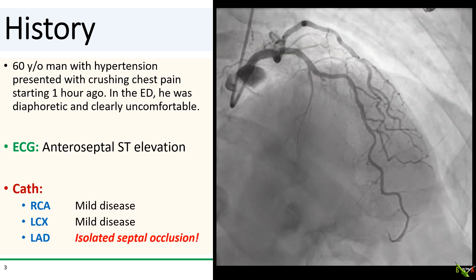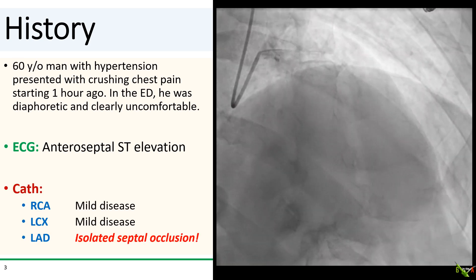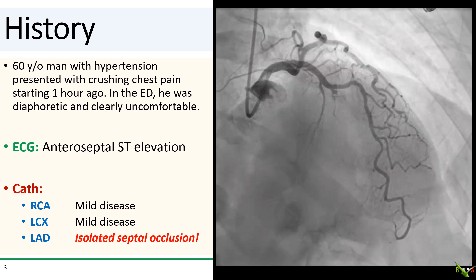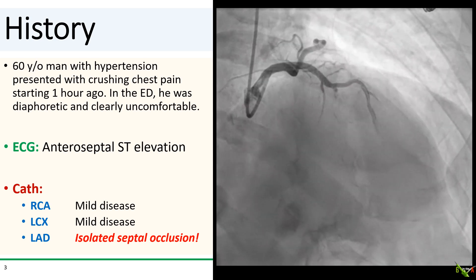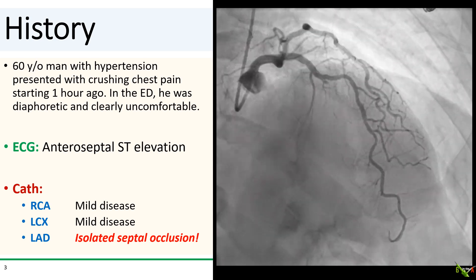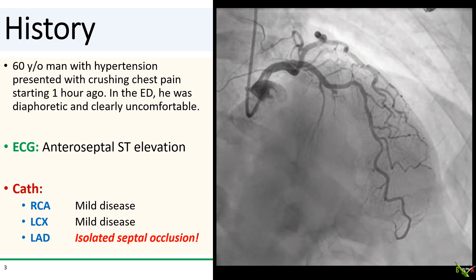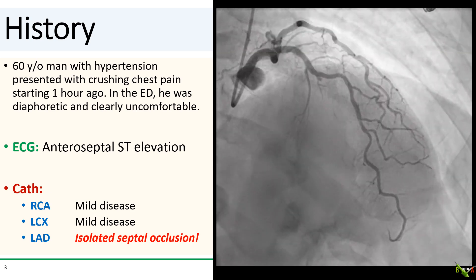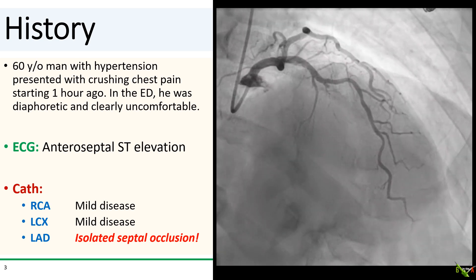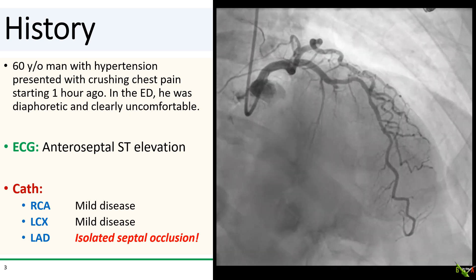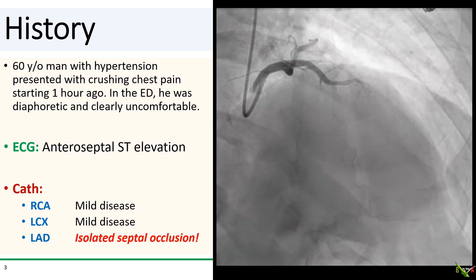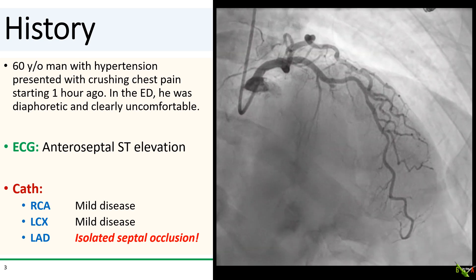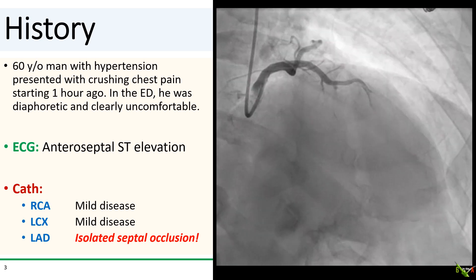On cath, the RCA and circumflex both had only mild disease, and surprisingly the LAD, which you see here, has mild disease as well. And if you look carefully, you can see that the culprit is the stumped-off septal branch originating in the high-mid LAD.